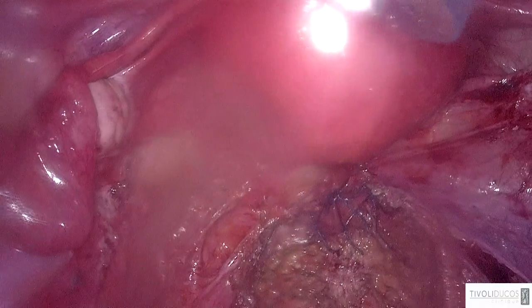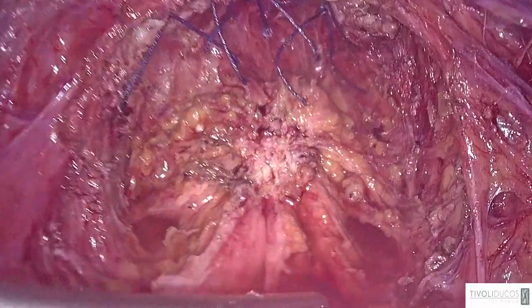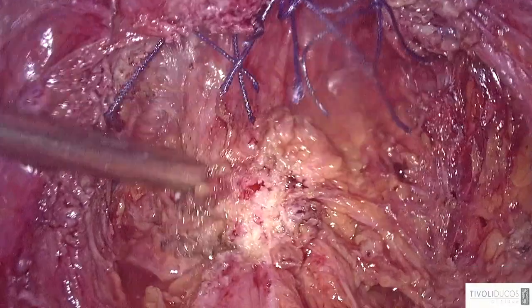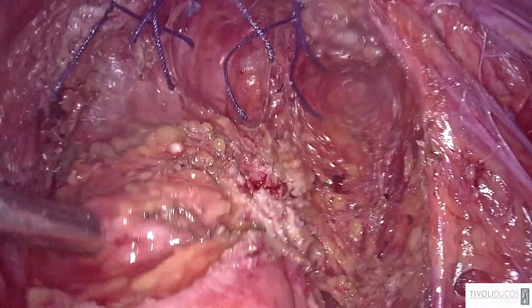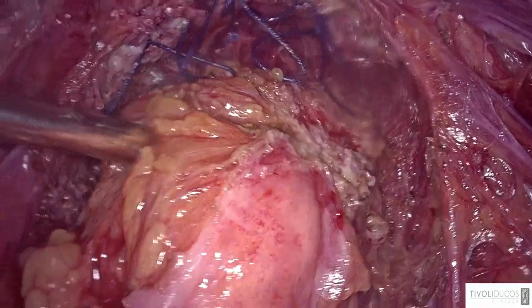to carry out a disc excision with the circular stapler, I have to prepare a soft and thin rectal wall, because the circular stapler cannot close directly on the nodule. So you have to remove the nodule, you have to do a shaving. It is too thick here. And also you have to remove all the fat tissue surrounding the shaved area, like this. You have to remove all the fat tissue, because the stapler should close only on the rectal wall.